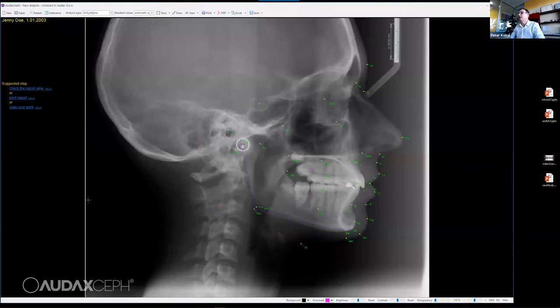And the software does the tracing for me. So what I need to do is check the report view. I can show the tracing points. I can do some changes if I want. If not, then it's okay. And of course, I can print the report and save it to a file. Super Easy and Empower have no database behind. You just save those files.